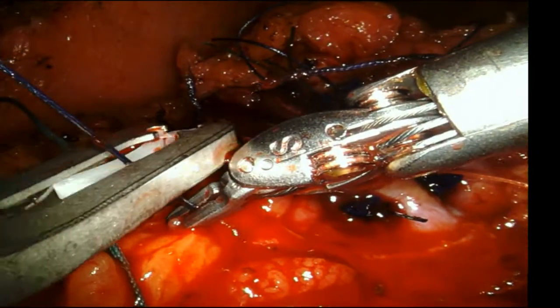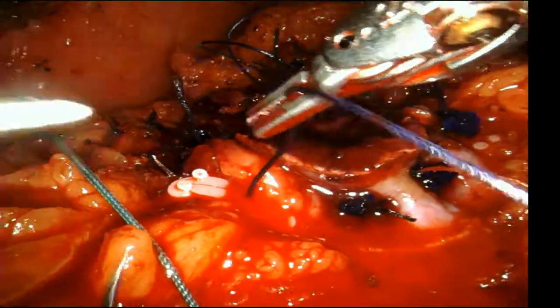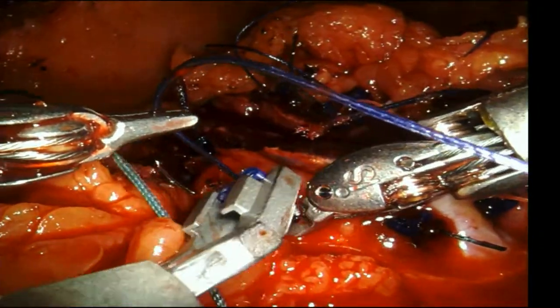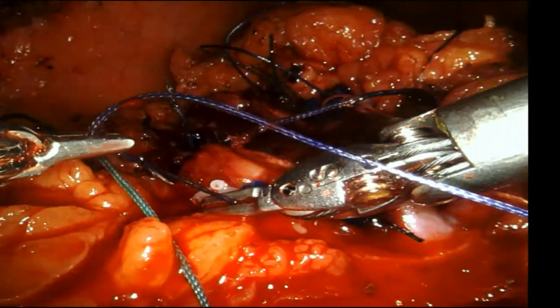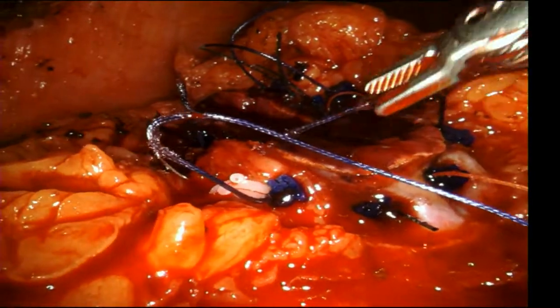I've done this on the larger defects. I've never done the XLH. That's a big needle. Yeah, I mean, that's the biggest one. That's a big needle, big. Yeah. But the CTX is actually pretty manageable, like what he's got going on here. So I think this works nice.